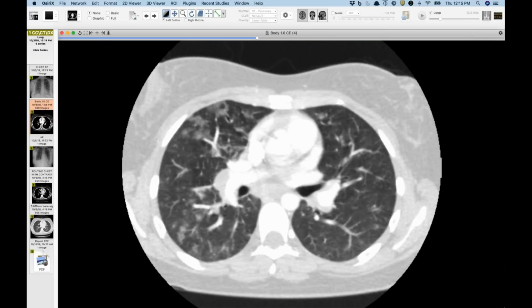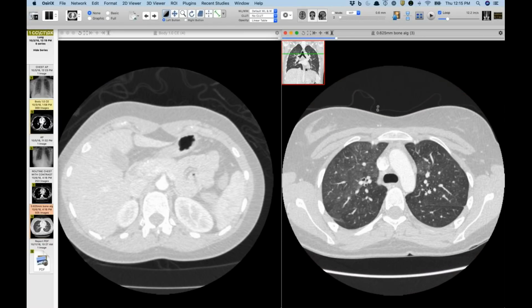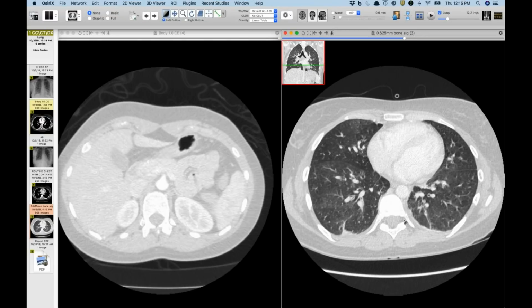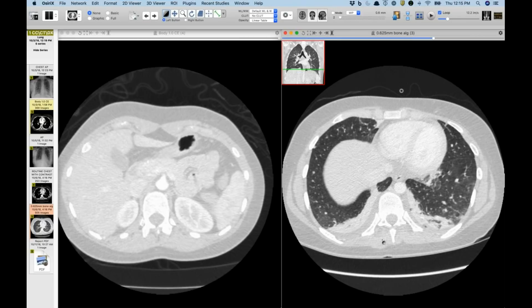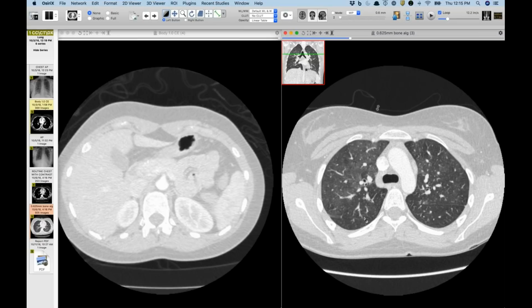And so this was exquisitely steroid responsive. She was immediately started on steroids for suspected acute eosinophilic pneumonia. And you'll see on her CT 3 days later that things have substantially improved. Within 24 hours of high-dose steroids, her symptoms had substantially improved as well. She's got trace effusions now. She was never bronched just because by the time she got here after starting her on steroids, she was so much better.